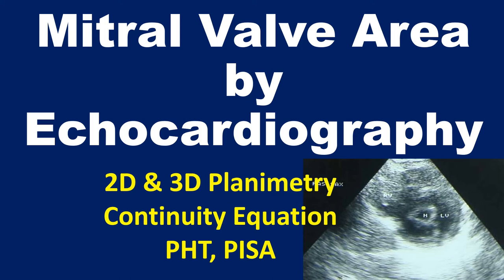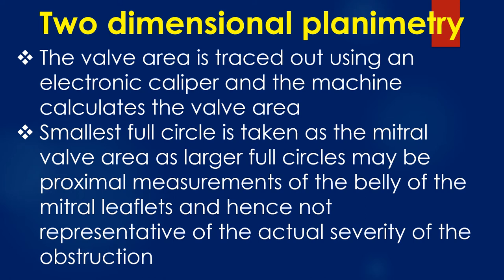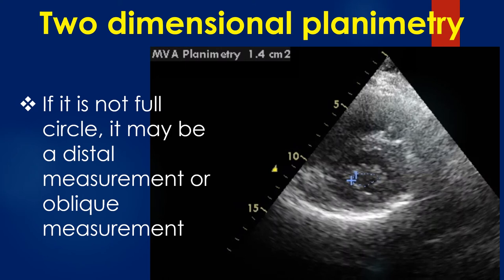This is a discussion on the assessment of mitral valve area by echocardiography using multiple methods. Though mitral valve area can be measured by multiple methods, the commonly used ones are two-dimensional planimetry and the pressure half-time method because of their ease of performance. In two-dimensional planimetry, the valve area is traced out using an electronic caliper and the machine calculates the valve area. The smallest full circle is taken as the mitral valve area, as larger full circles may be proximal measurements of the belly of the mitral leaflets and not representative of the actual severity of obstruction.